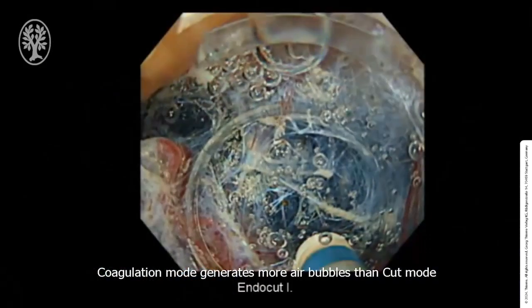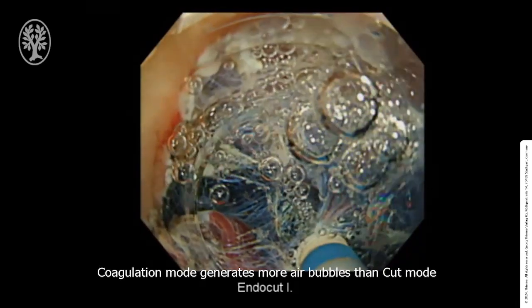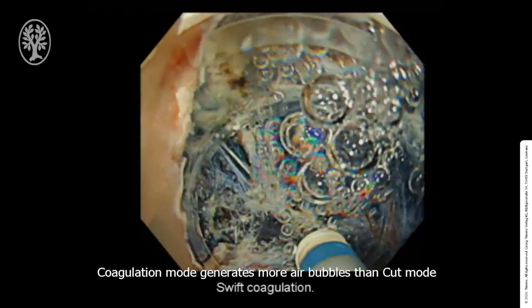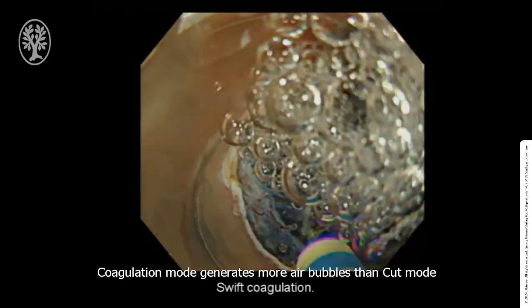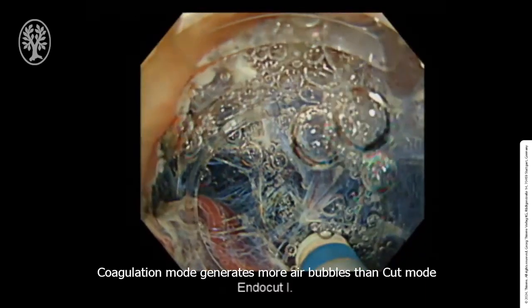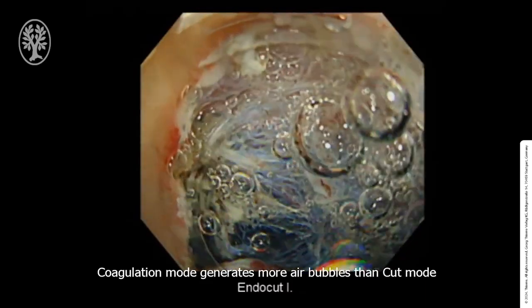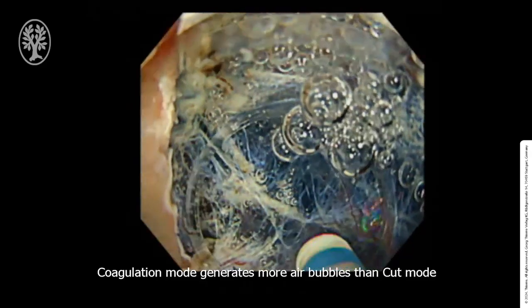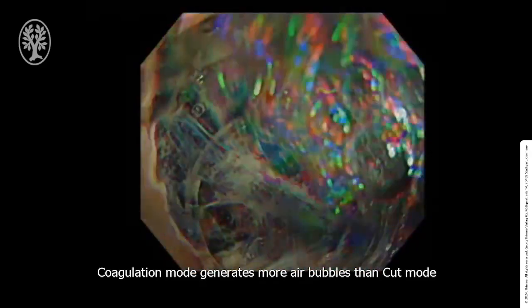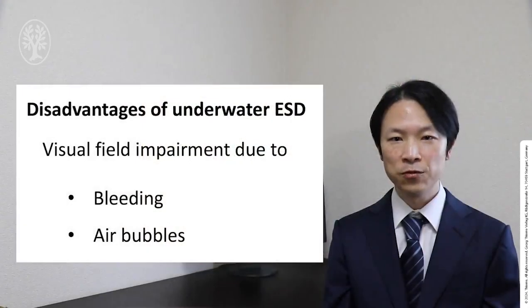Because the coagulation mode generates more air bubbles than the cut mode, there can be a hesitation to apply coagulation mode for submucosal dissection, resulting in insufficient coagulation of vessels. Such an event would increase the frequency of hemostasis in the underwater ESD group. Therefore, it is necessary to overcome visual field impairment due to bleeding or air bubbles during underwater ESD.